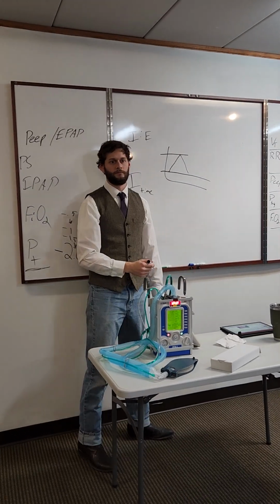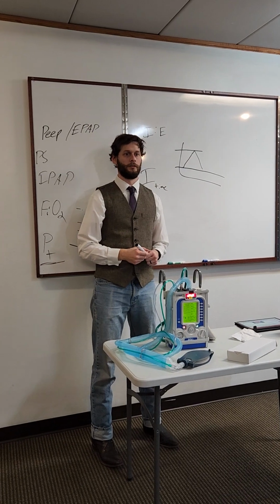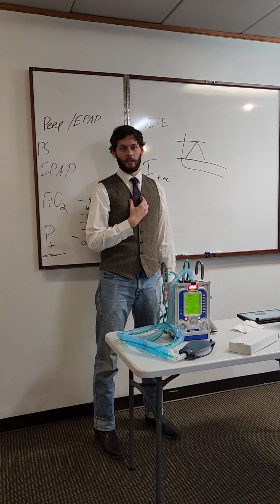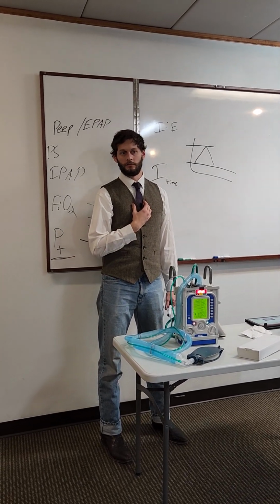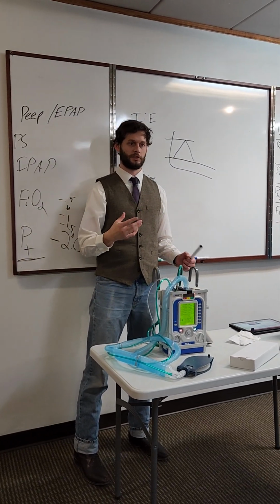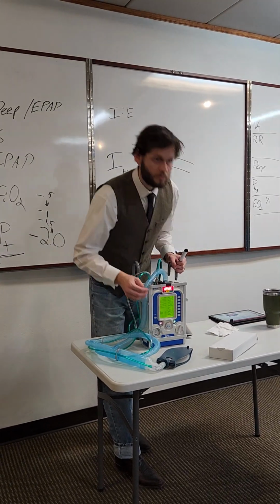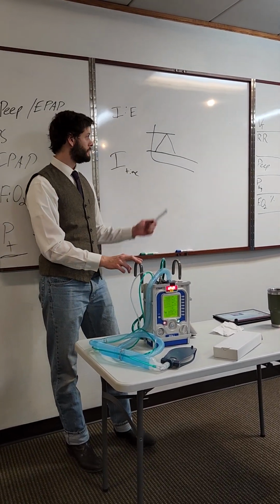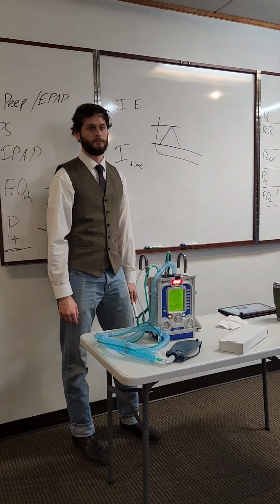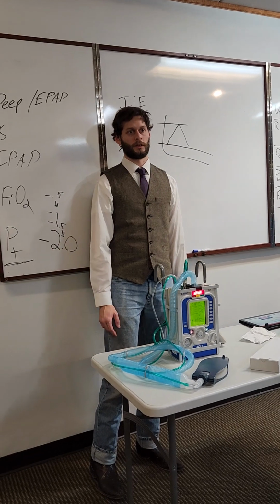And why would we do that? You would do pressure control or volume control when damage to the airways is usually the greatest concern. So with pediatric patients, the risk of barotrauma is much higher, so we're going to be more concerned with pressure control. You want to monitor and manage the pressure versus the volume if there's damage.